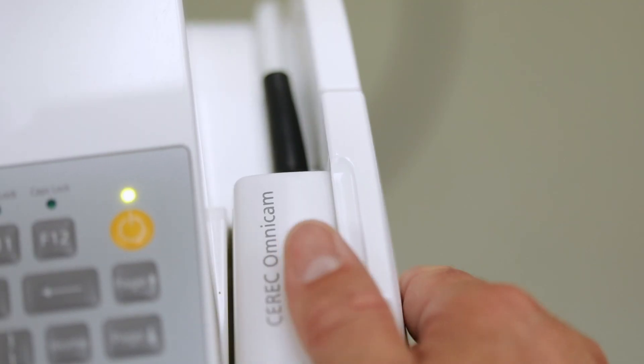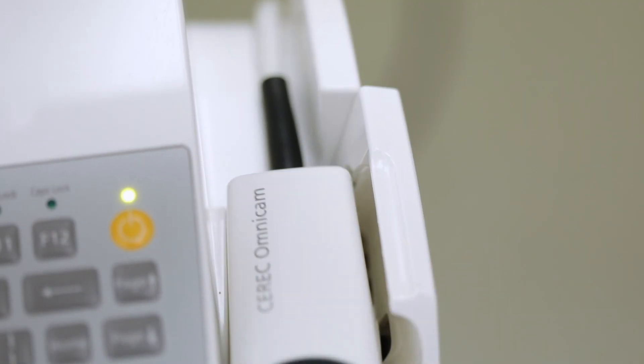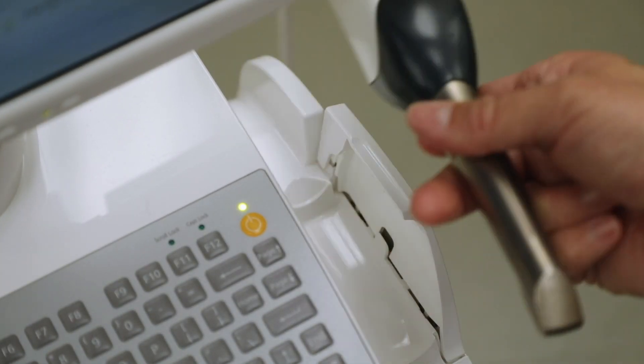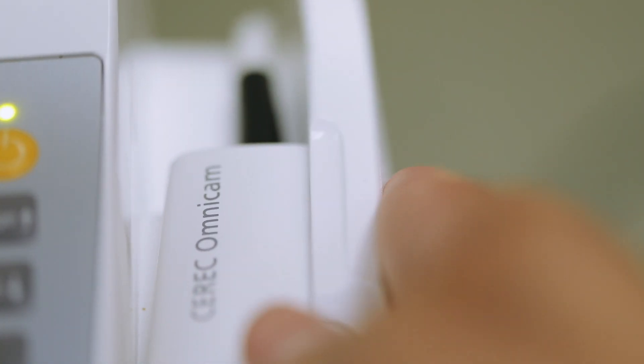I would always keep this in the lock position when not using the camera. This is to prevent accidental bumping or dropping of the camera. These cameras are very expensive to replace if they are damaged.